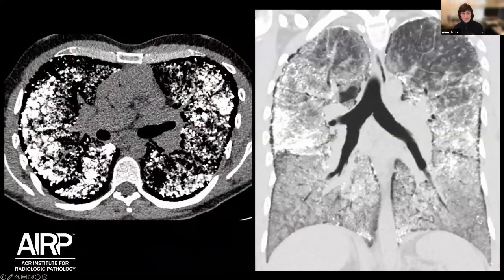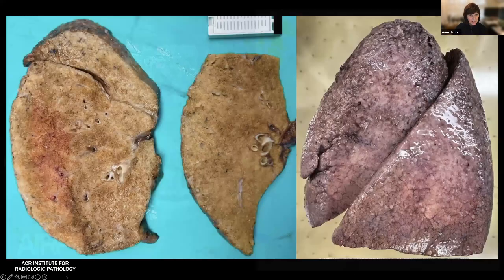And then one more CT picture, just confirming again that there is widespread, pretty diffuse, high density calcific material in this micronodular morphology that has some extreme juxtapleural clearing, which again, looking back on the coronal reformat, really looks to be almost like a paraseptal cystic pattern, this fine black stripe. It also harks back to what we saw in the radiograph.